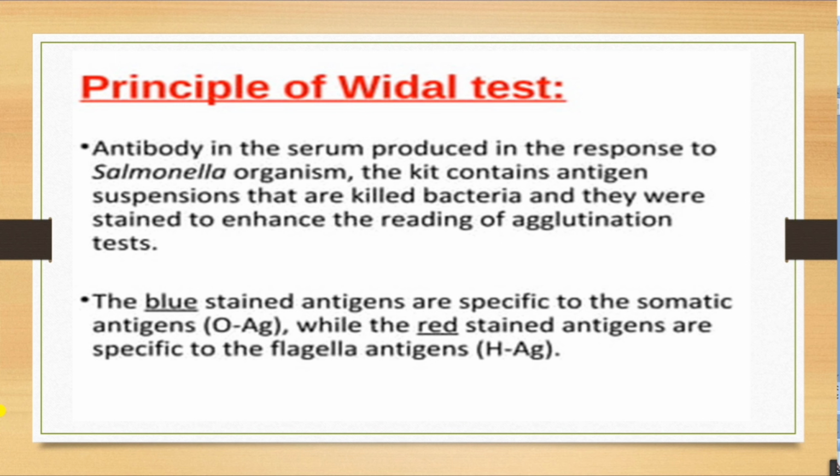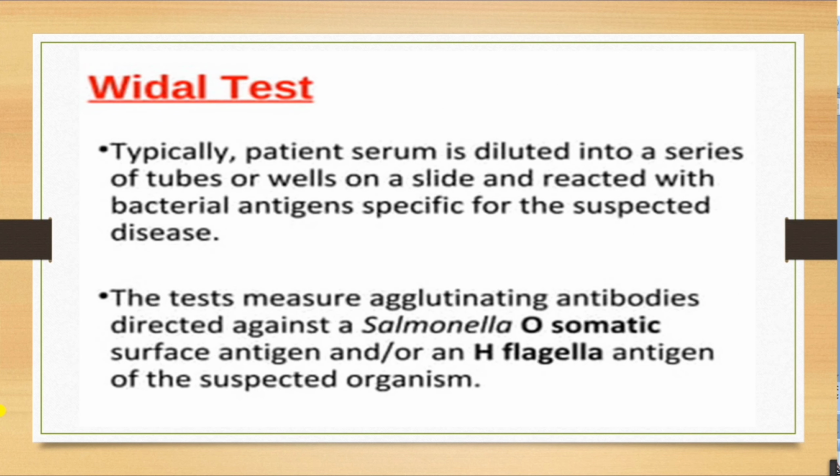The blue stained antigens are specific to the somatic or O antigen, and the red or pink stained antigens are specific to the flagellar or H antigen.